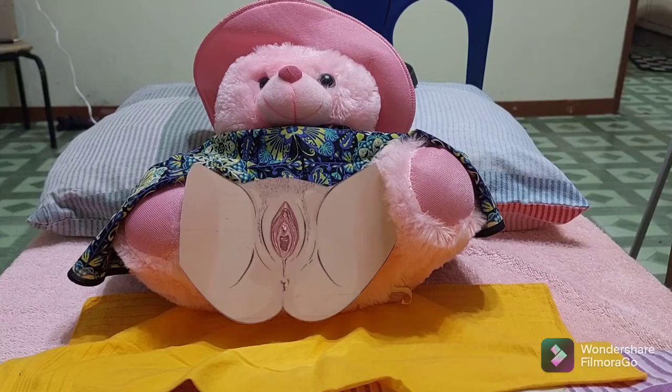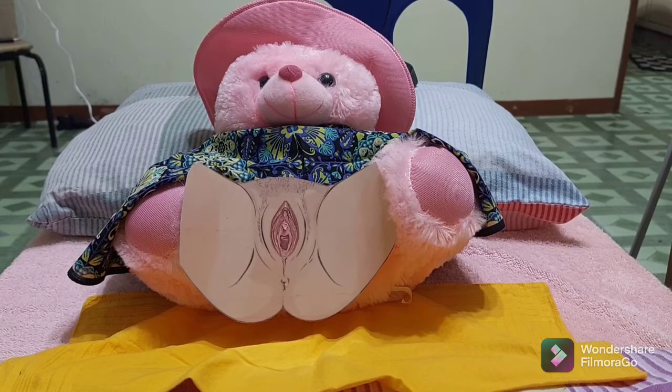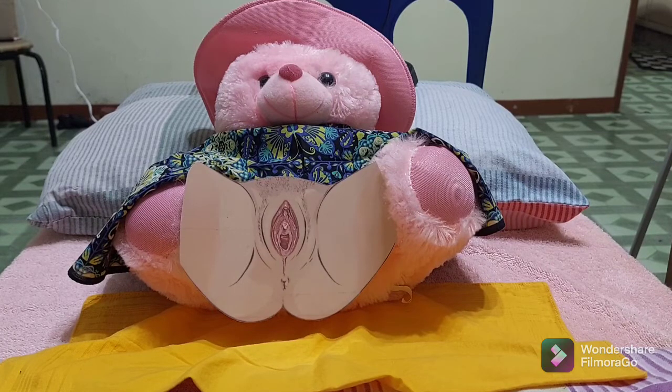Drape the patient with the drape found in the catheterization kit, either using sterile gloves or using ungloved hands and only touching the outer edges of the drape. Ensure that any sterile supplies touch only the middle of the sterile drape, and that sterile gloves do not touch a non-sterile surface. Drape the patient to expose the perineum or penis. The outer 2.5 centimeters is considered non-sterile on a sterile drape.